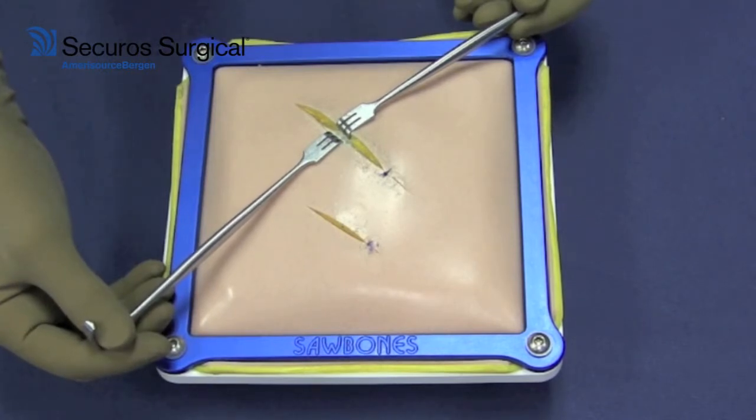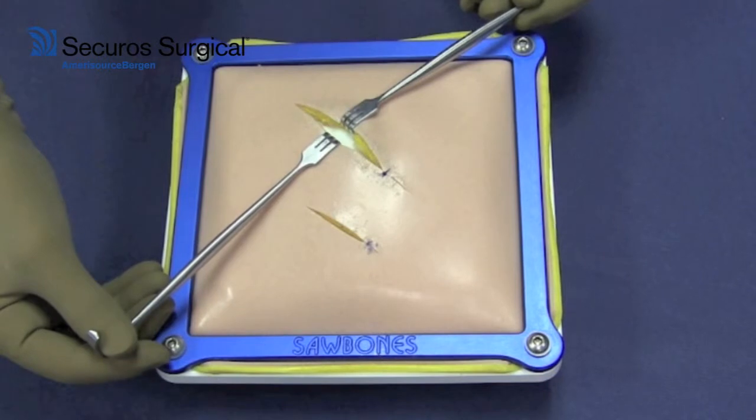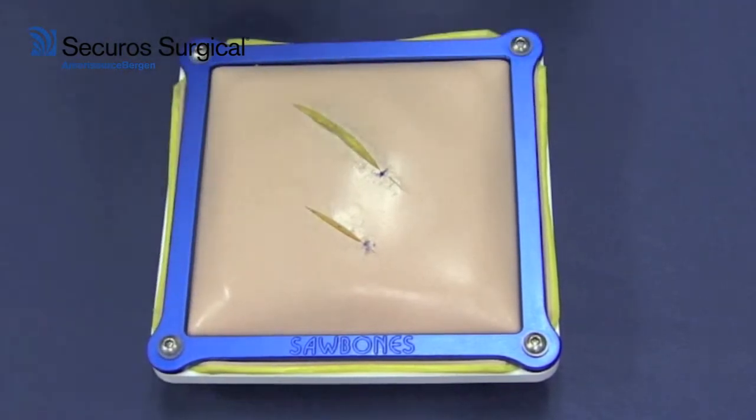Typically, you might have occasion where you would have a surgical assistant retracting the skin edges with Senn retractors; however, that mandates that you have a surgical assistant whose role is principally as a retractor. You can save those resources by using a galpy retractor.